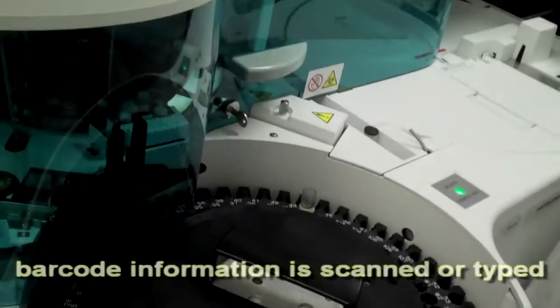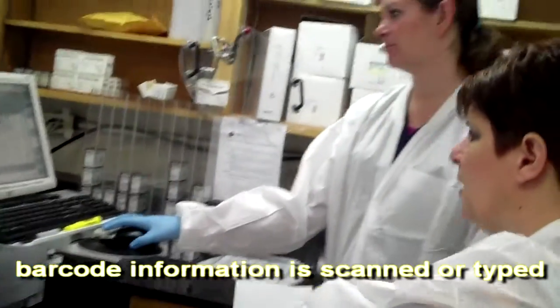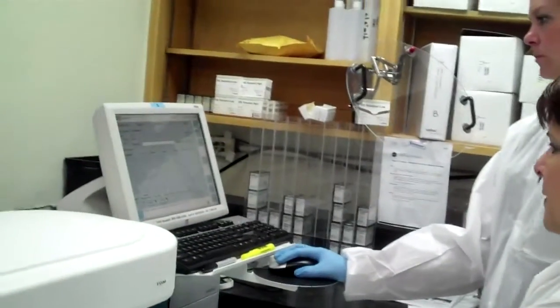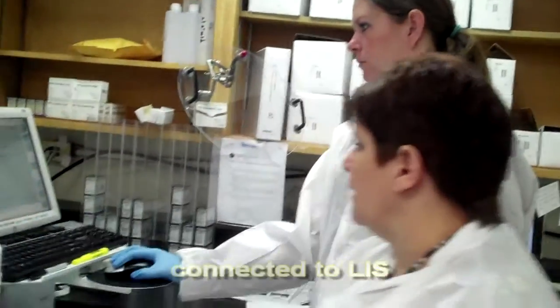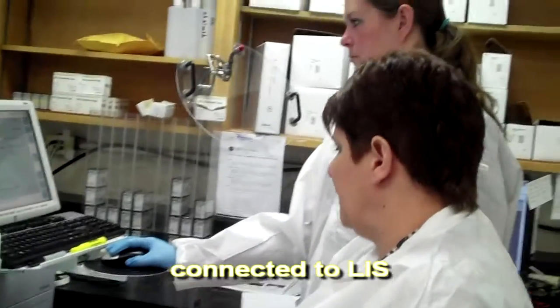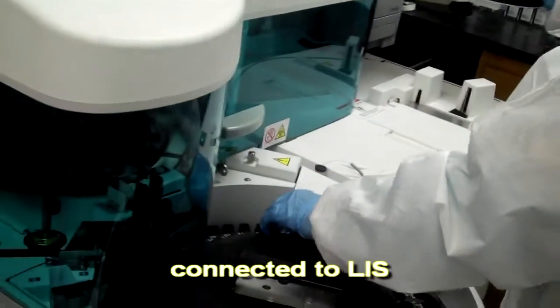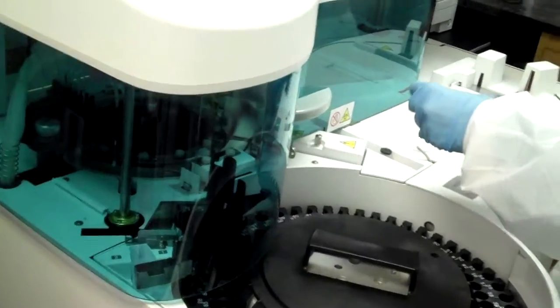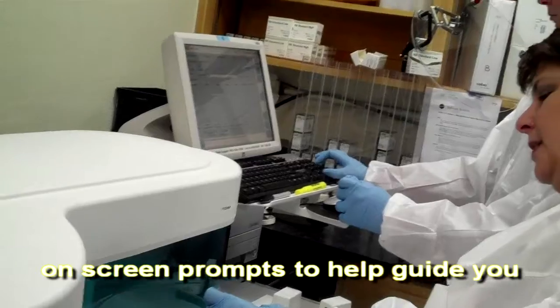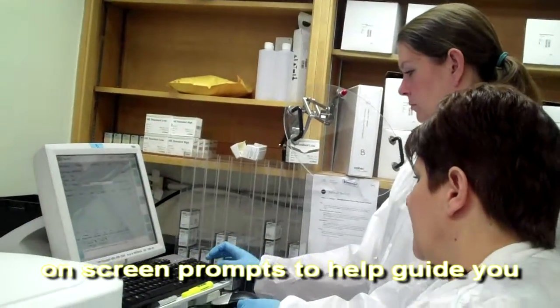But from here on out I have to tell it exactly what I want it to do. So if you want to take the mouse, just double click on test selection, right there where it's gray. Okay, now click on stat. Now the cursor jumps over to the sample ID and we're going to have to manually put in this barcode. So it's N3057 50409. Okay, hit enter.